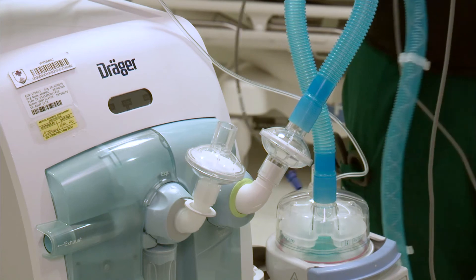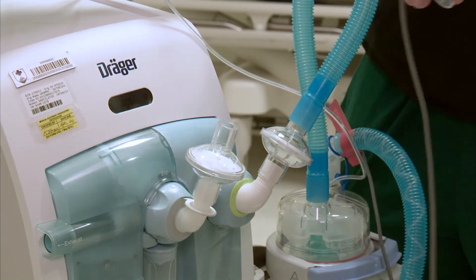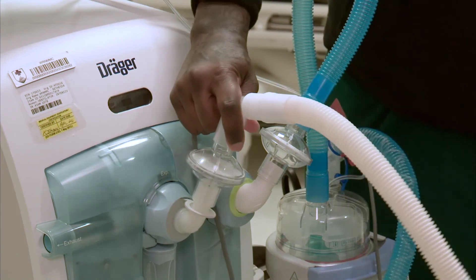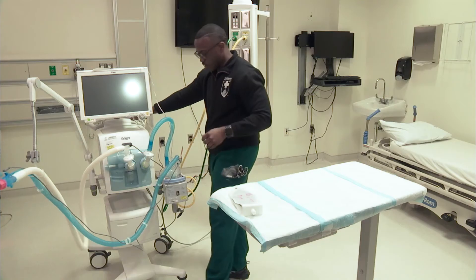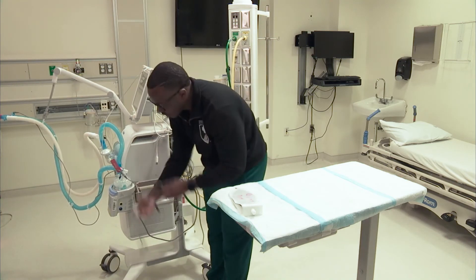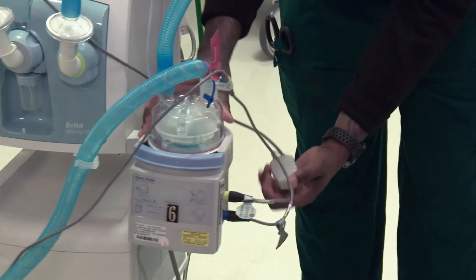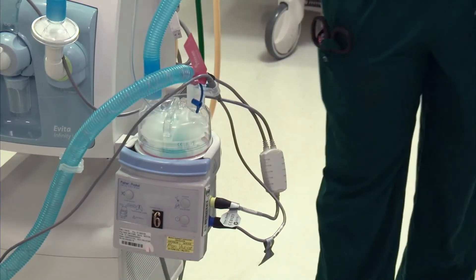I'm going to connect the circuit. The inspiratory line and then the expiratory line is going to go on the expiratory side. I'm going to rotate the machine so you can see what I'm doing to the external heater. These temperature probes — yellow should go to yellow and then blue should go to blue. Now I know my temperature probes are all connected on my circuit.